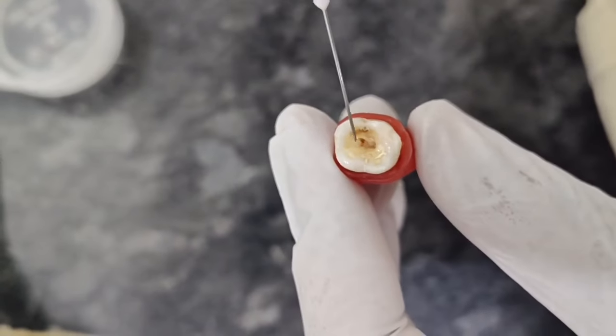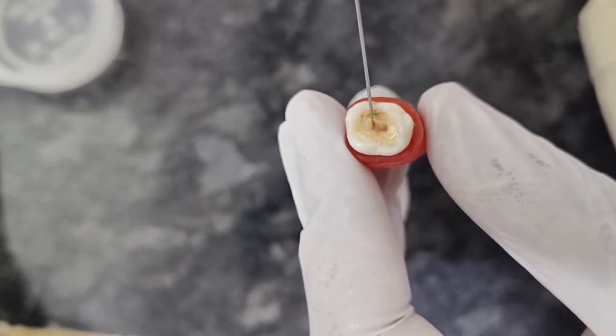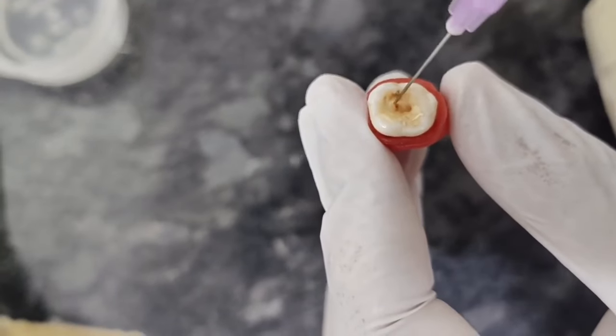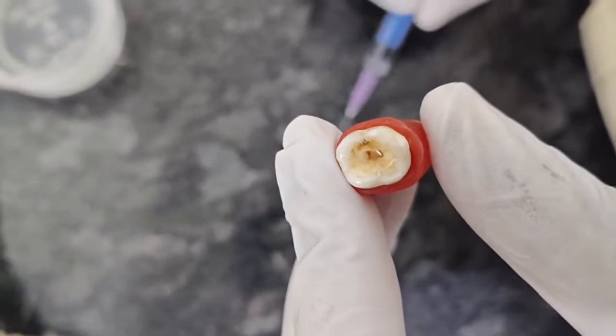Then what I do is I give 2 drops of liquid EDTA solution, which is easily available in the market. So I have just put it. So what does it do? It softens the dentin, and you can easily do the filing with the K files or with the rotary endomotor.